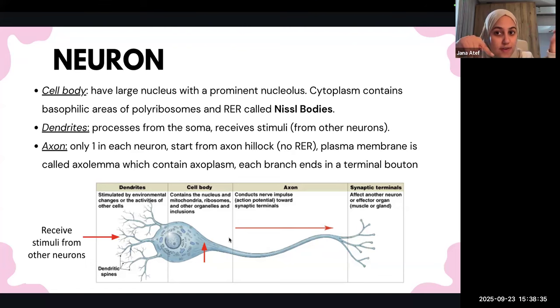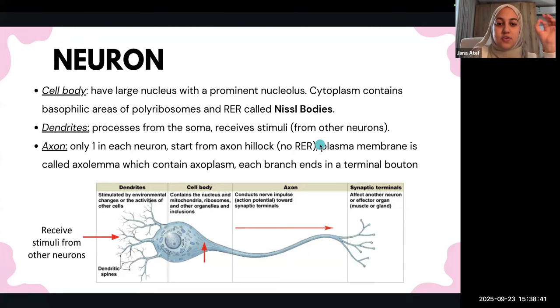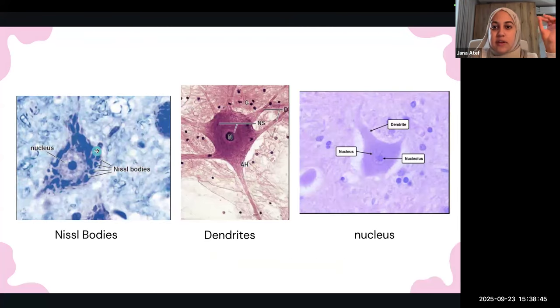In the cytoplasm of the soma. Exactly. It's found in the cytoplasm of the soma. This is where you find the Nissl bodies, okay? Here it is, another identifying feature of a neuron. Okay, why do I keep mentioning identifying features?